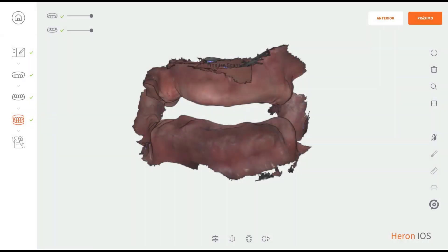Voila! Now you can inspect the virtual models and move on to the finalization page to finish your case.